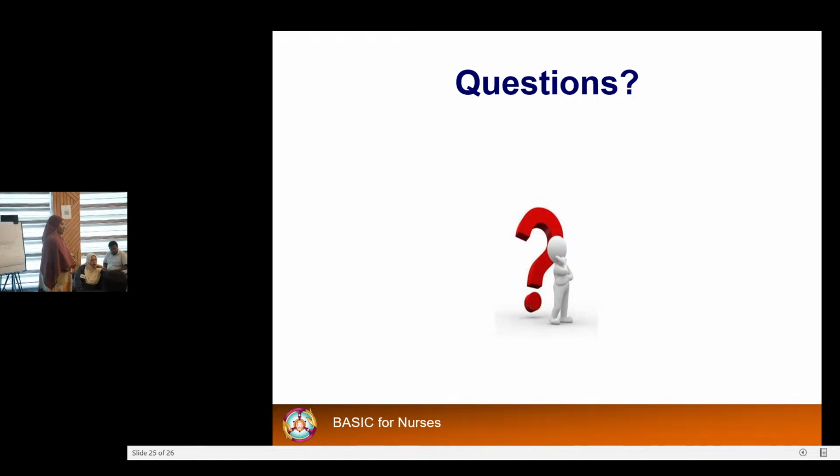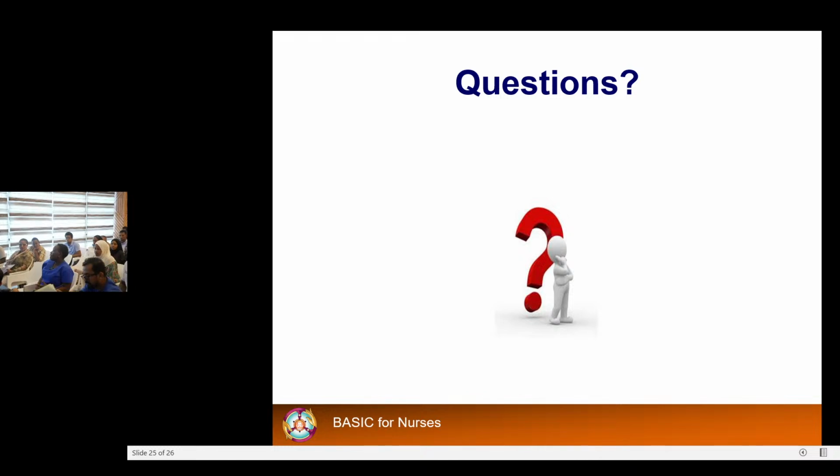My name is Margaret. I'm a cardiovascular nurse from Jakaya Kikwete Cardiac Institute. Concerning the CVP, we basically follow the IPC recommendation from the Ministry of Health. So for us, it's 14 days, 2 weeks. But as the doctor said, you can change it if there is any sign of infection like inflammation, redness, or if you see pus. So you can change it even after 5 days. So the maximum is 14 days.